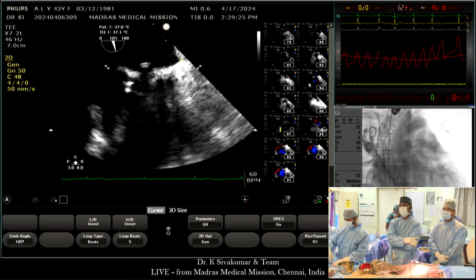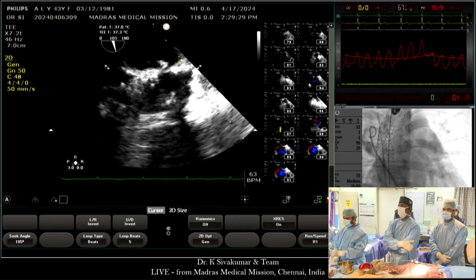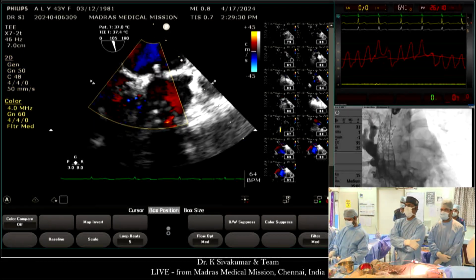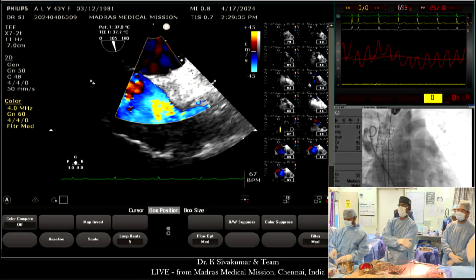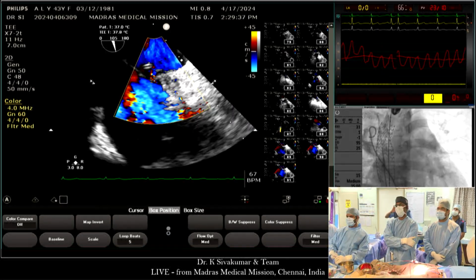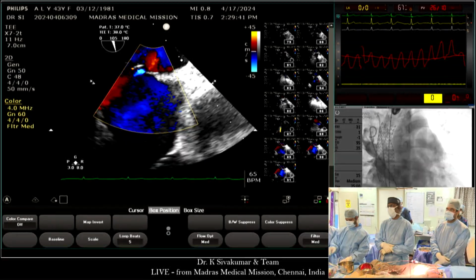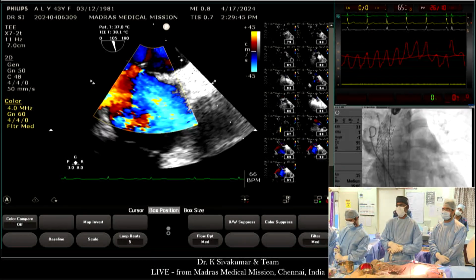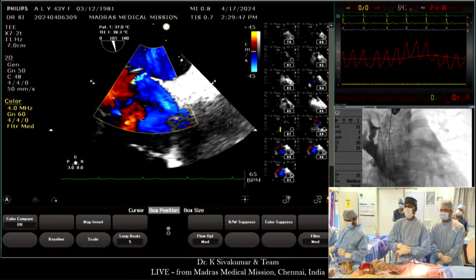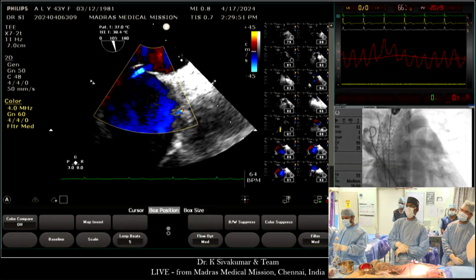Can you explain why the pulmonary veins are so dilated? I mean, they look a bit dilated. Restrictive LV physiology. We are showing that the pulmonary venous pressure now is about 16 millimeters of mercury. When I started, it was somewhere around 8 to 9 millimeters. It has increased to 16. I will give a pullback from the pulmonary vein into the left atrium and right atrium, and you will appreciate that this is a 43-year-old lady having some amount of restrictive LV physiology.